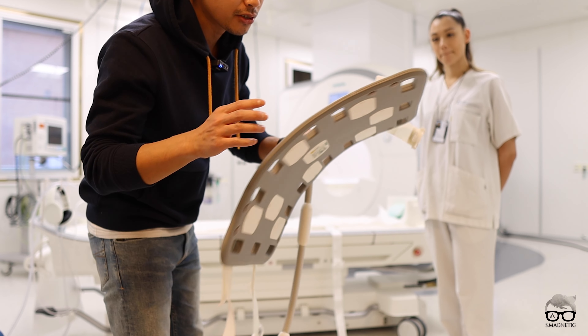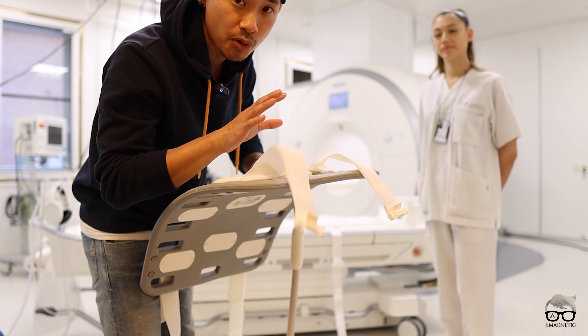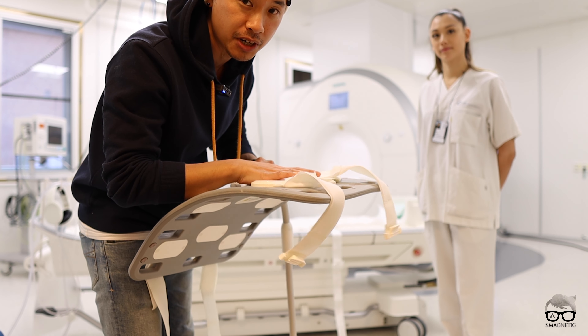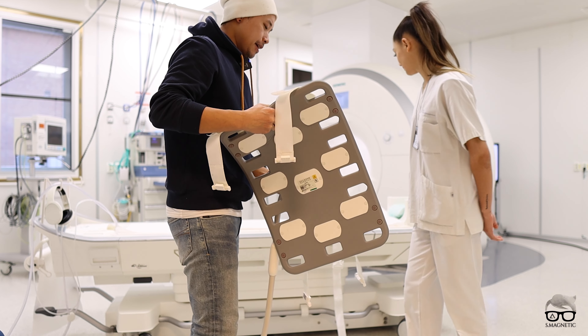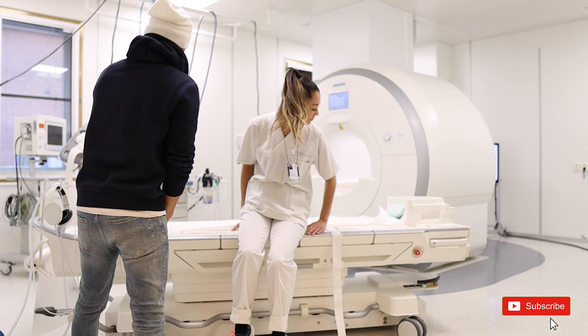Whenever you're doing body imaging and you have this body coil, you have these four straps. I'm going to show you how you can work faster and fasten this much easier whenever you're alone.